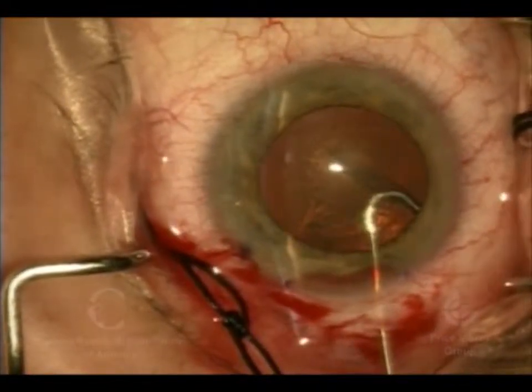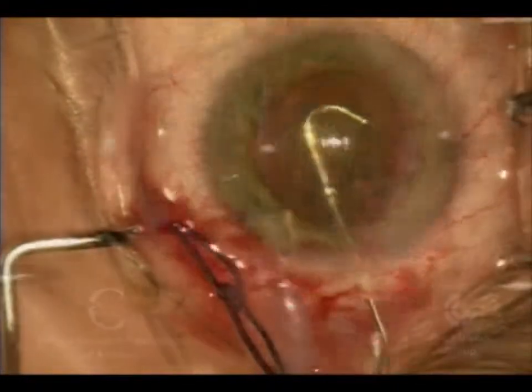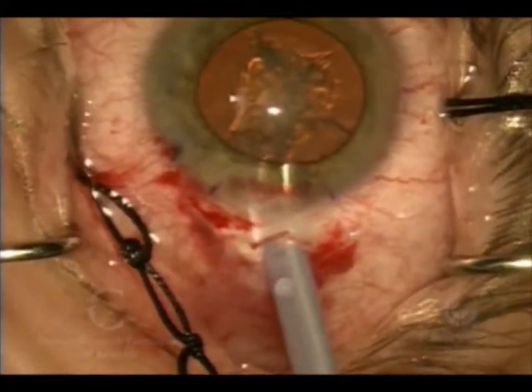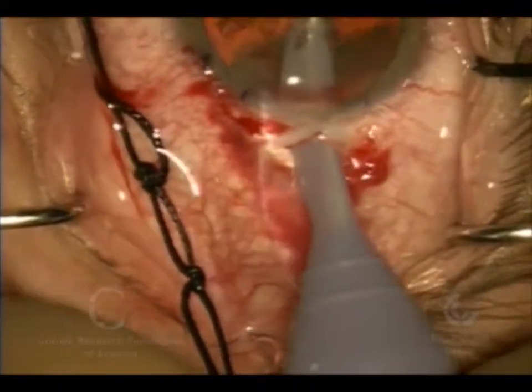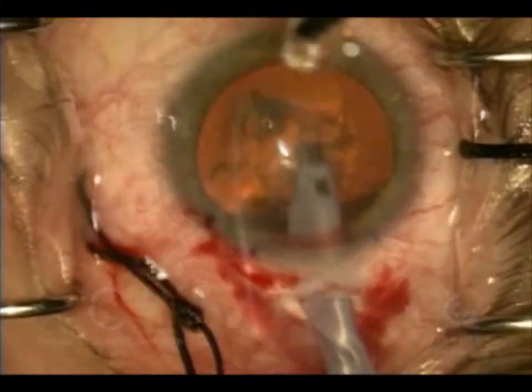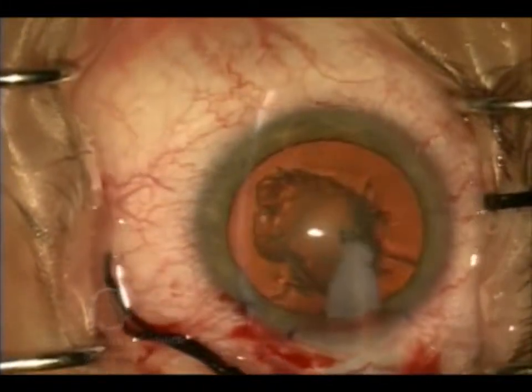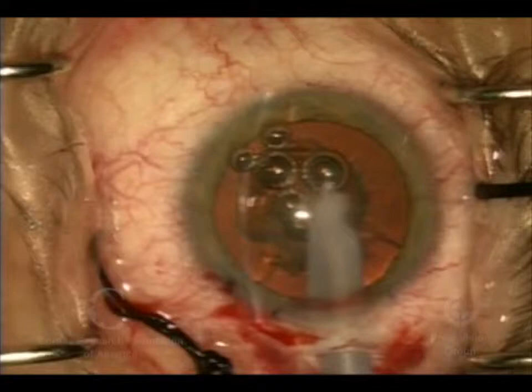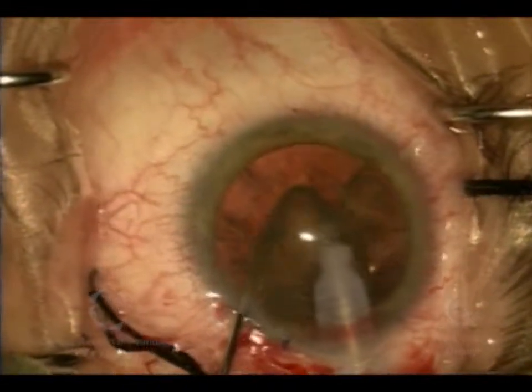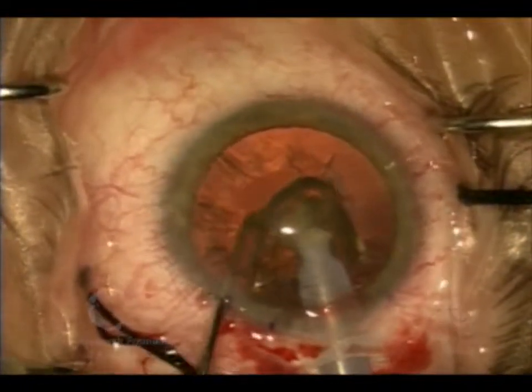We've taken that tear all the way around — it's continuous and round. We're injecting fluid between the capsule and the rest of the cataract, causing those layers to separate. This is an ultrasonic phaco tip that we're using; with ultrasound it breaks up the lens material. We have fluid going into the eye through the purple tubing and sucked out through the center of the metal one.